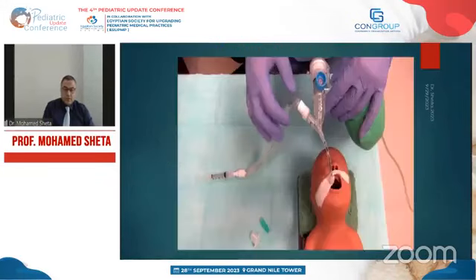I will show you here in this picture a way of closed circuit surfactant administration. This is a very nice way if you have a baby who is ventilated. So in these babies, we can connect the tube with this Y-shaped top of the tube to connect the ventilation in one limb and to connect this circuit in the other limb. This is closed circuit surfactant administration.